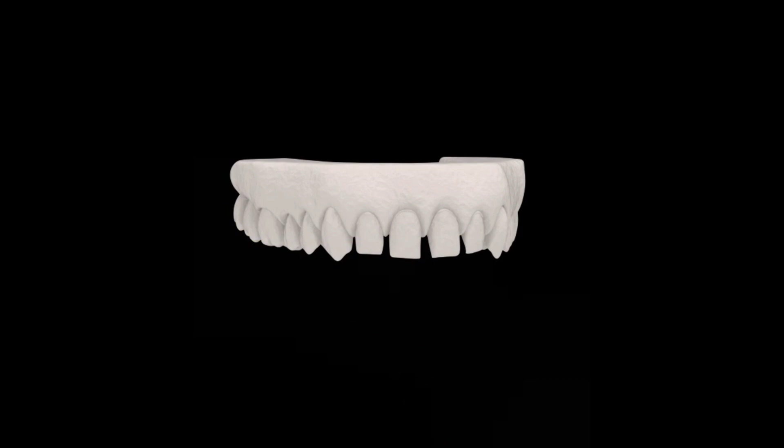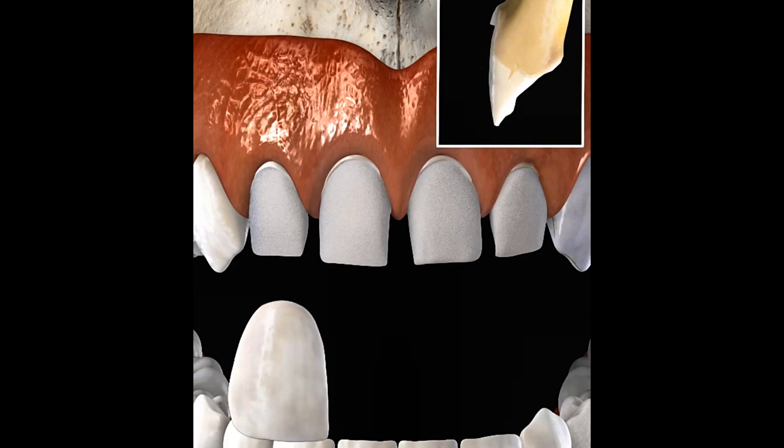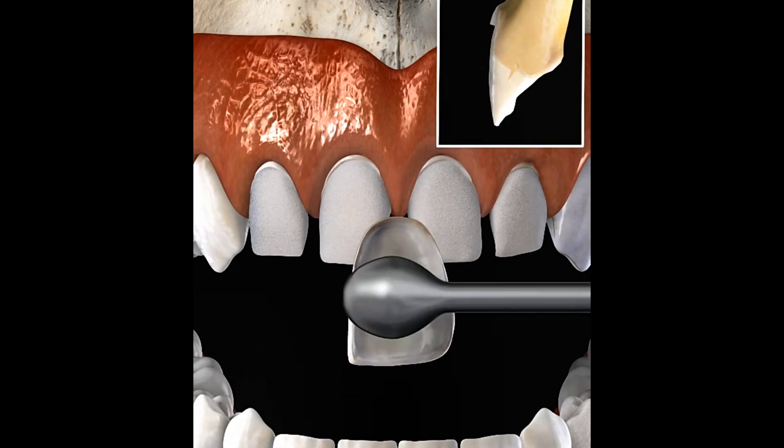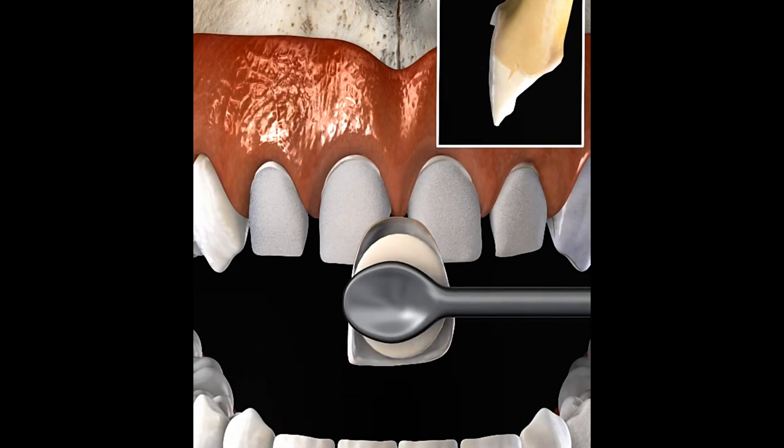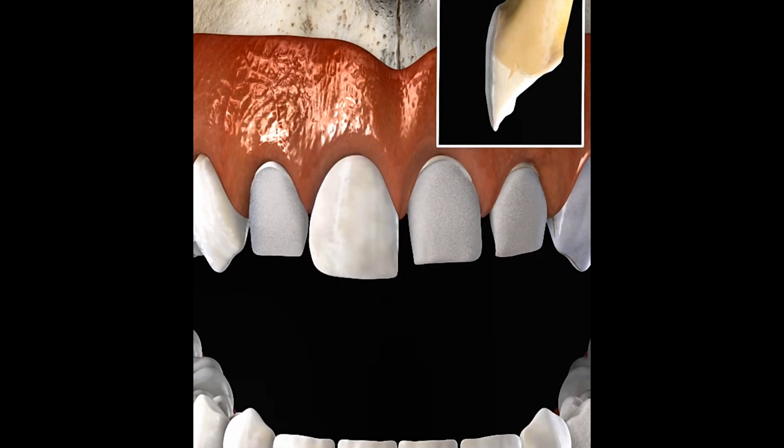When ready, the veneers are sent back to the dentist, where the dentist fits them using cement which is applied to the back of the veneer. Any additional cement is removed using a scaler. Additional veneers are fitted using the same method.